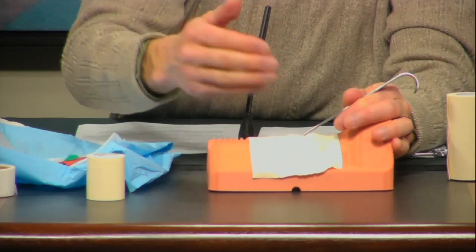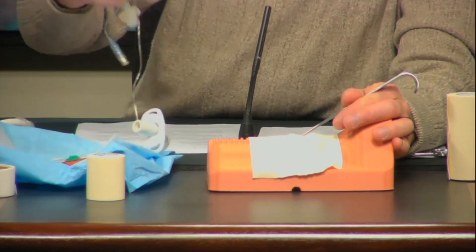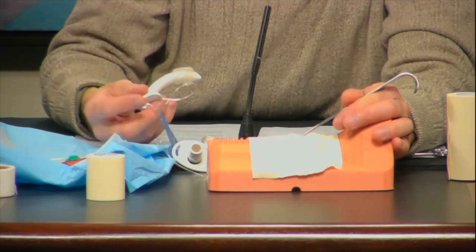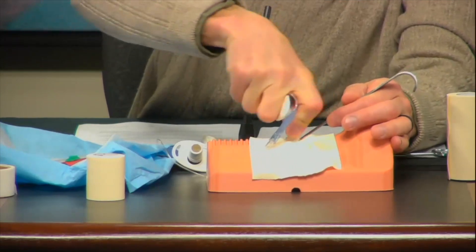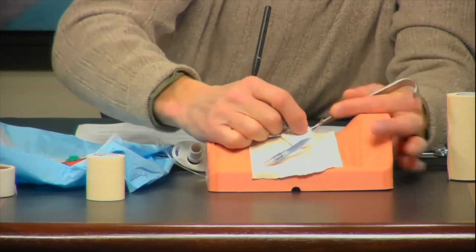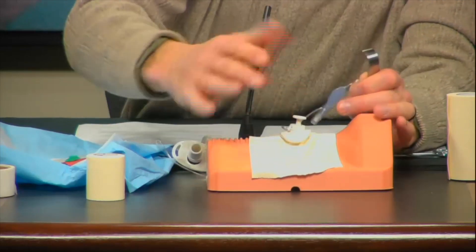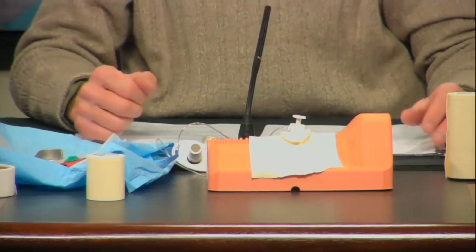We're ready to place our airway. You can use an endotracheal tube, or a bougie like this, to pass through. You'll slide the airway through the opening. You can inflate your balloon, secure it — whatever you want to do as part of your normal procedure.